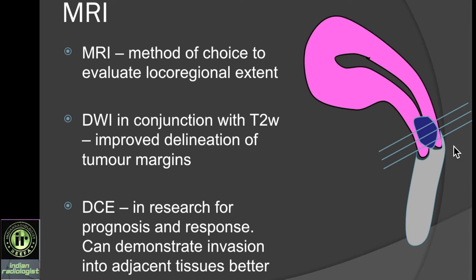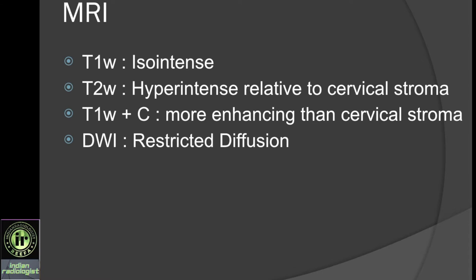This image shows how to protocol your scans. The blue part is the tumor in the cervix. Your axial slices should be oriented perpendicular to the endocervical canal and your true coronals are going to be perpendicular to these. On MRI, the tumor is going to be isointense to cervical stroma on T1 sequence and hyperintense compared to the cervical stroma on T2 sequences. If contrast is given, the tumor is going to be more enhancing than the adjacent cervical stroma and will demonstrate restricted diffusion.